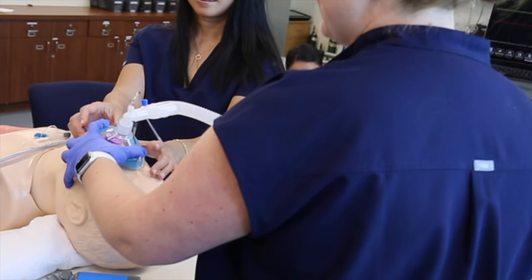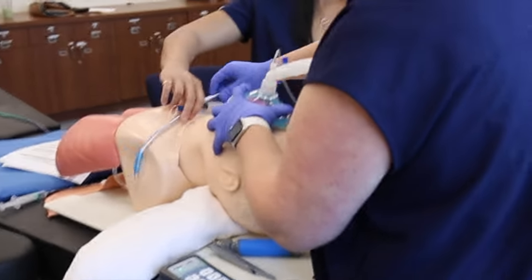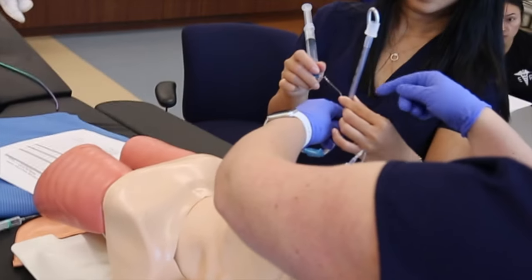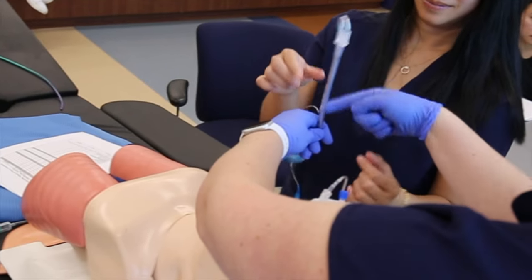All right, so we'll say 90 seconds have passed, so I'm going to ask you to hand me the tube when the time comes. So just hand it to me like that. So my hand will come here. You don't need to hold the syringe. Okay. So hold it with this hand. There you go.